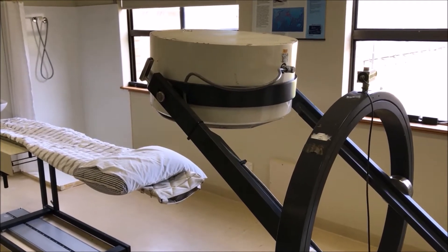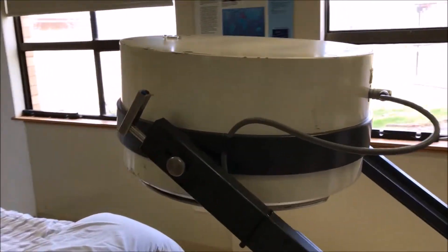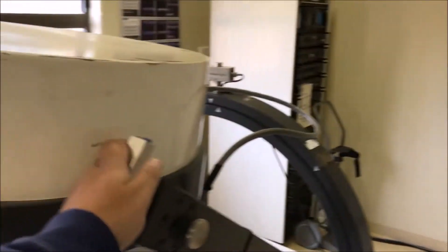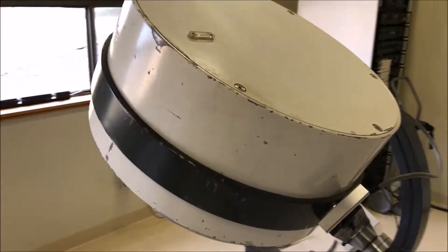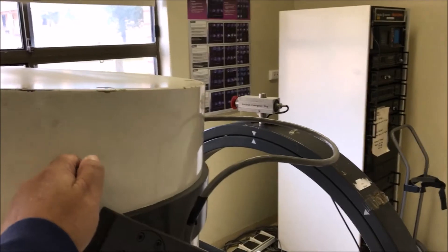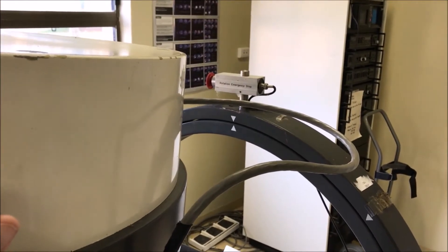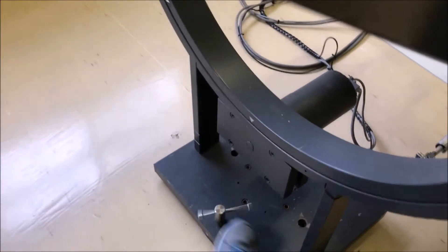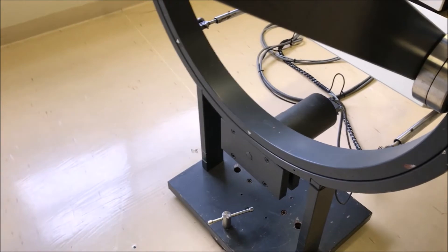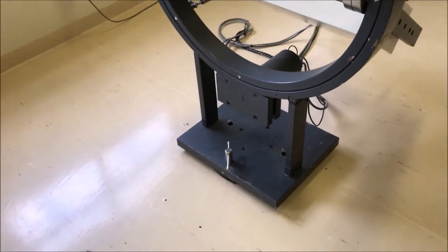We'll talk about SPECT in a separate video, but essentially having this camera rotate around the patient — taking a picture at a position and then rotating to take pictures at different angles as it comes around the patient. The problem is that when it sits out on an arm it needs physical stability. The alignment is very manual — it's got electromagnetic braking, so I could flip that off and rotate the camera left and right, allowing me to do patients sitting up. It's very versatile but I'm relying on my physical alignment to be in the right spot for SPECT.